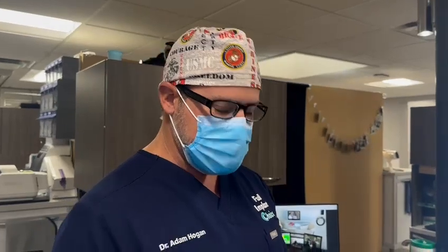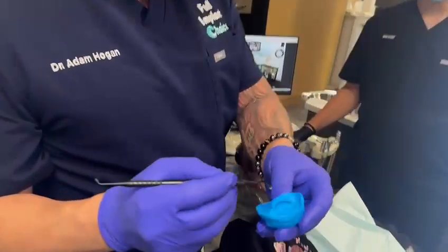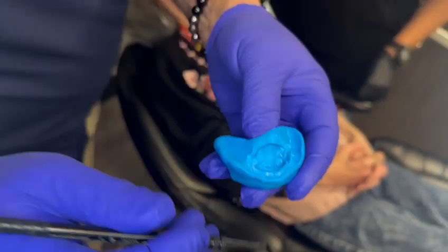We've got our records this morning. Upper edentulous arch, lower about six or eight teeth, no dentures in place. You can always make a wax rim and call them back tomorrow or next week. But what we've done, through three putty bites, we've gotten the right vertical, and then I'm cutting out a trough right here to pick up a little light body so I've got some detail of the rugae to align.